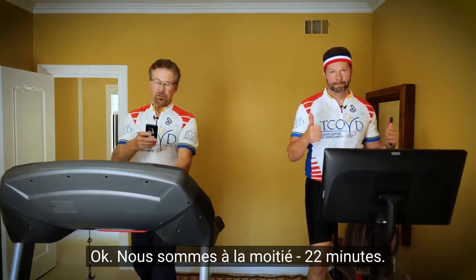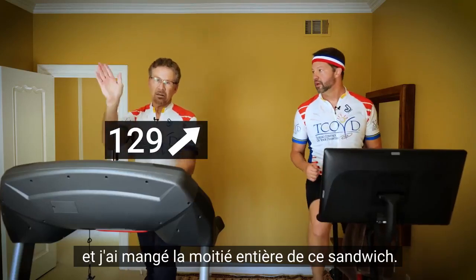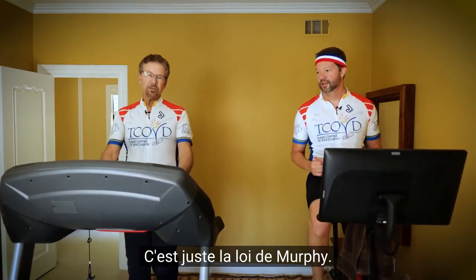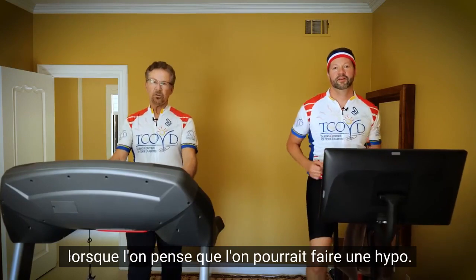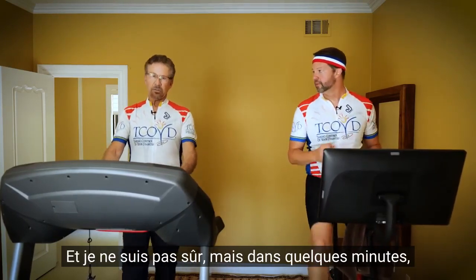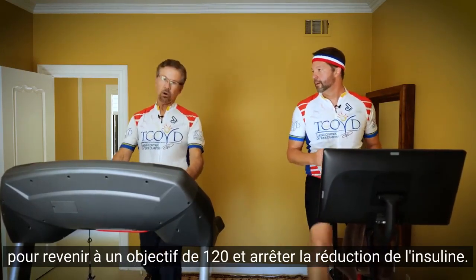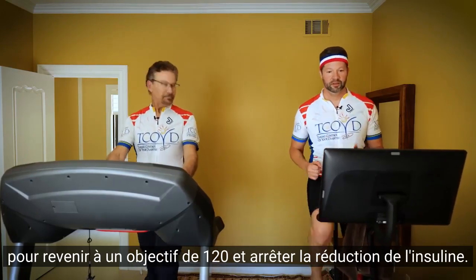Okay, we're halfway through, 22 minutes. My blood sugar is 129, diagonal up. And eating that whole half sandwich, it's finally sinking in. And you know what? It's just Murphy's Law. It's always tough to eat the right amount of food when you think you might get low. And I'm not sure, but in a few minutes, if it doesn't flatten out, I'm going to turn off my pump settings so it goes back to a goal of 120 and turn off the reduction in insulin.